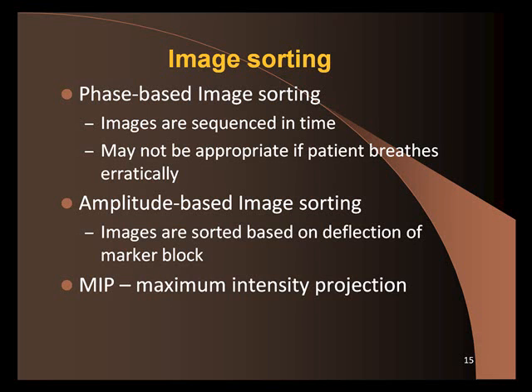And so you have this little window that you're trying to treat through, and then maybe the patient spent a lot of time in that bottom portion when you did the CT scan, but when you treat, they're erratic and they spend very little time in that portion. And so the beam is on very little, and it's very inefficient, and it takes really long to treat the patient.